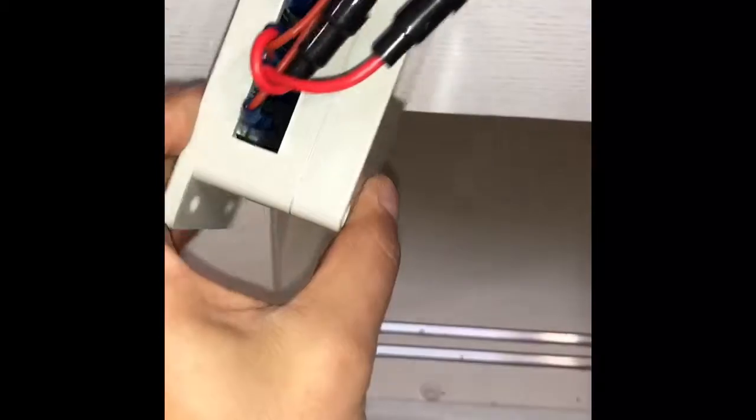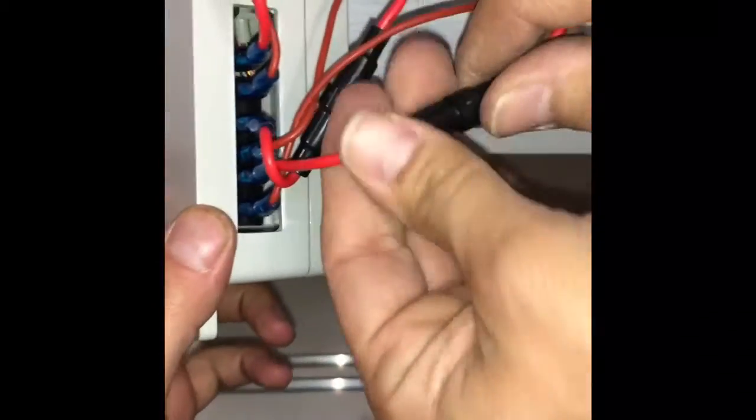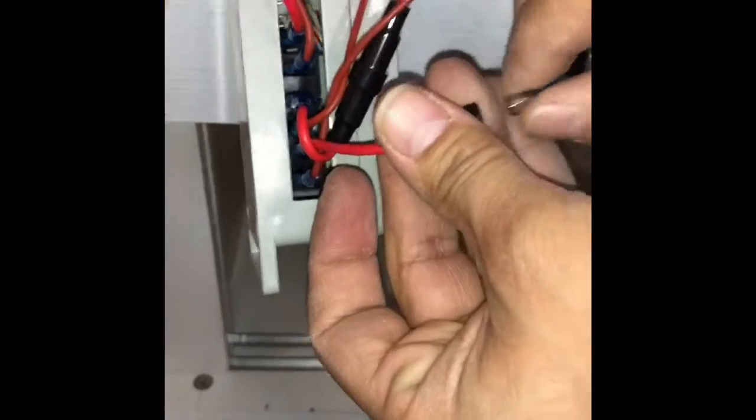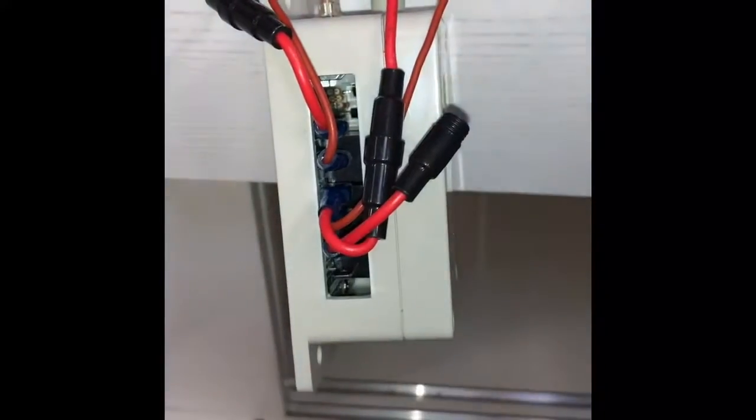And once you find that wire, which is gonna be this one right over here, we're gonna go ahead and disconnect it. For you to be able to remove the pad, you have to disconnect the cable. So first we're gonna open up the fuse, make sure the fuse is taken out. And the next wire that is connected to the board itself, it's gonna be the one that has the blue plastic covers on them.